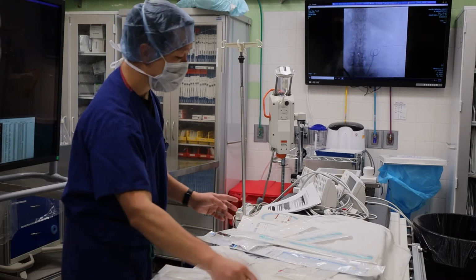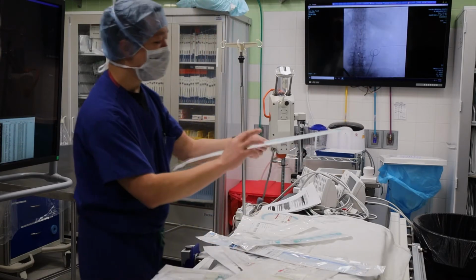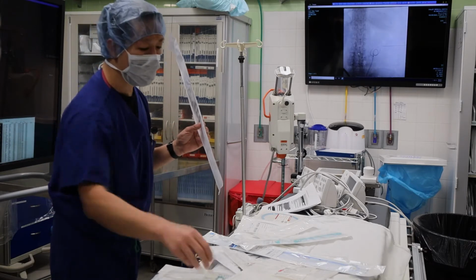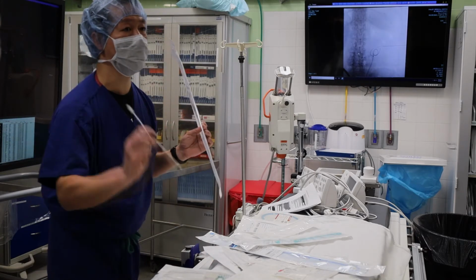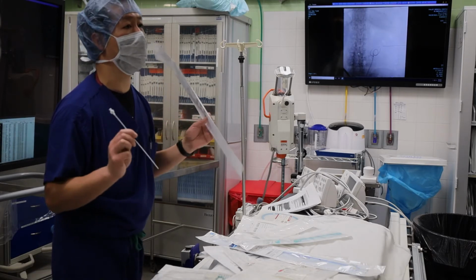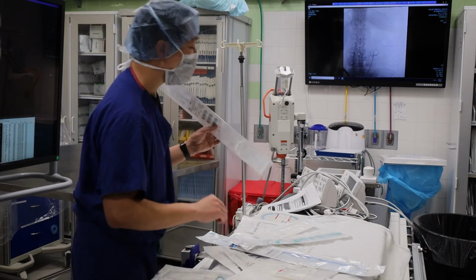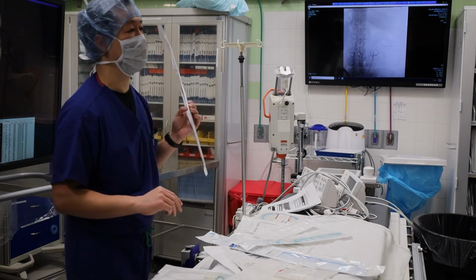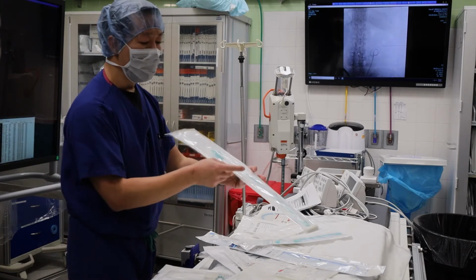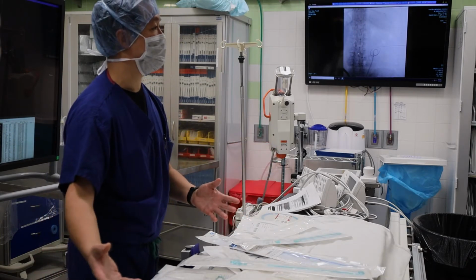Okay, good. So 6 French system going to an 8 French perc Neph, you probably don't need a dilator, probably. If the pushing of this is a lot of resistance on feel, we might ask for an 8 dilator because we're just not sure, okay? So that's the reason why sometimes we use it. Rare for people to go straight to a 10 French from the get-go. You can, depending on the indication, but normally we put in an 8. So you put in the 8, pus starts coming out of our imaginary patient, okay?